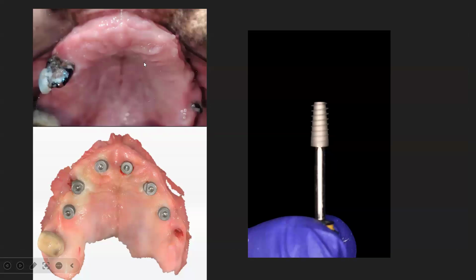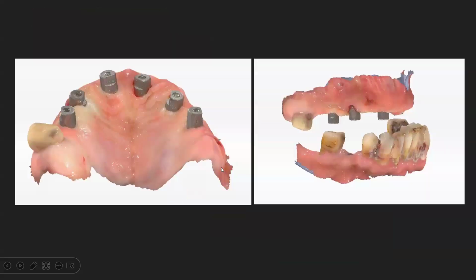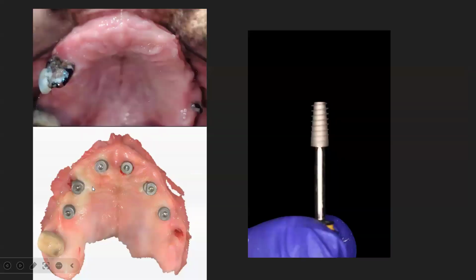This is my daily protocol. Implants, and then scanning. You see here the scan body of MGM. It's low profile scan bodies, metallic low profile scan bodies, which make your scanner run very fast on them without needing stitching or extra. Another scan body was introduced in the market lately, which has the horizontal scanning protocol or central scanning protocol, and this makes our life easier than the old big and tall scan bodies, they were hell to use. But these are easily used.